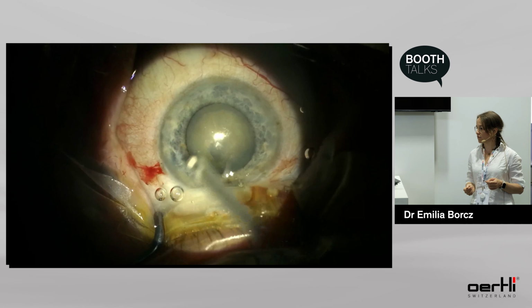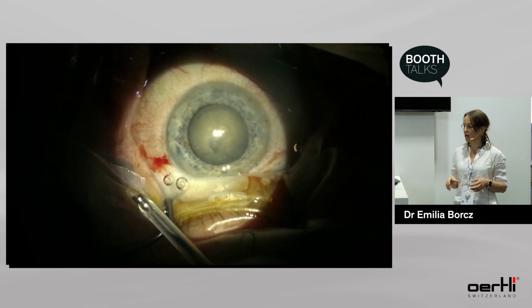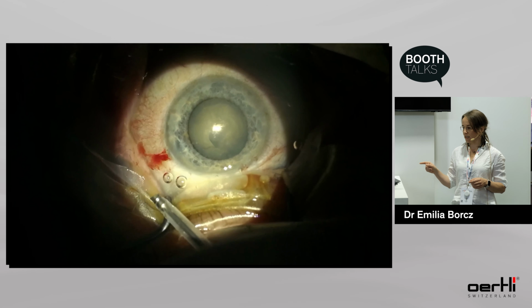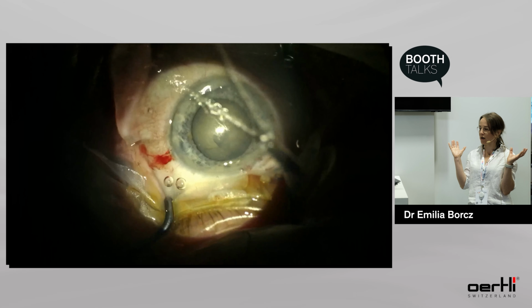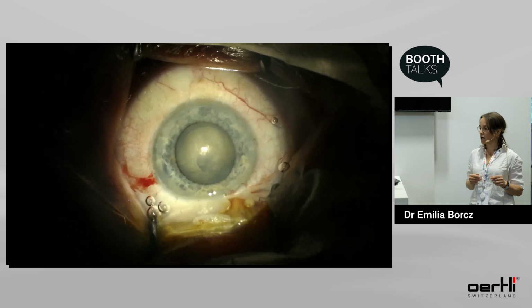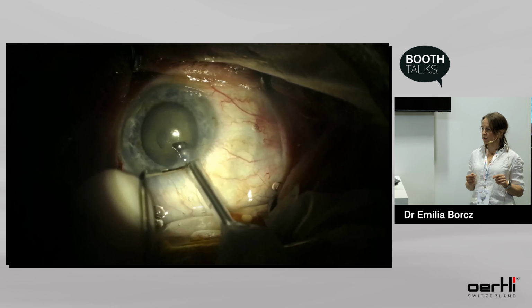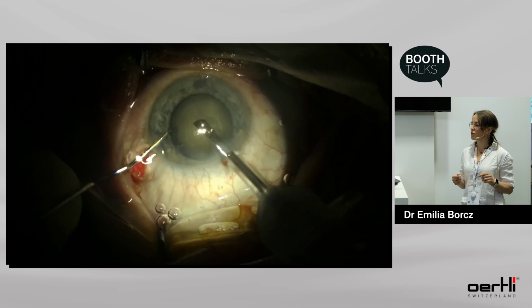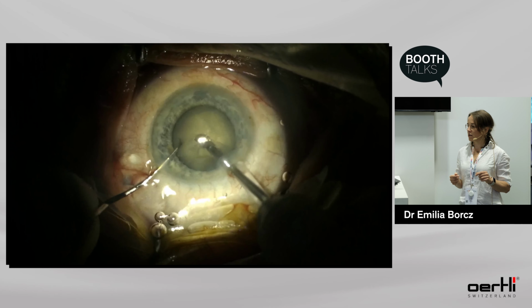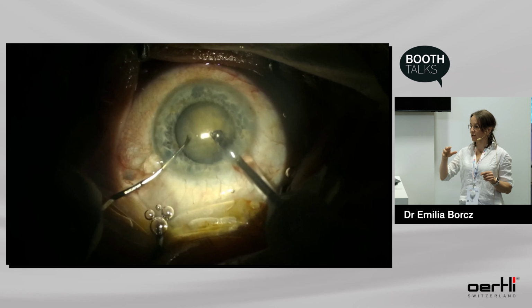Here is the first cataract that I would like to show you. This one is quite hard but brittle. Always I check the sleeve to see if it's put in the right position. The opening needs to be parallel to the opening of the tip. And as I said, I use just one program for pre-phaco. Now you can see I will do pre-phaco. And I try to give bevel down and a little bit sideways.